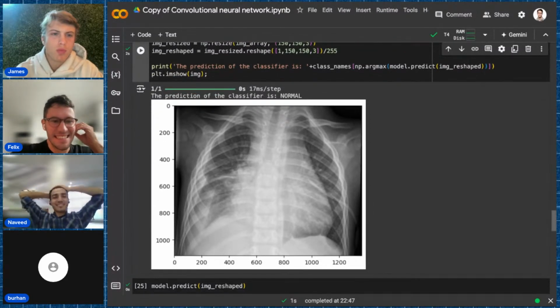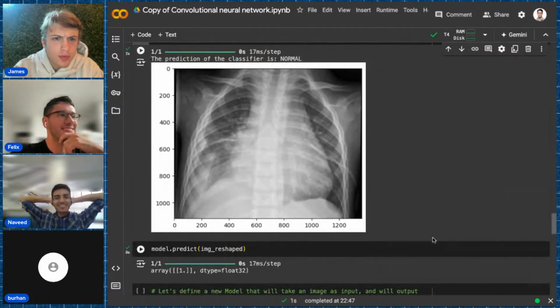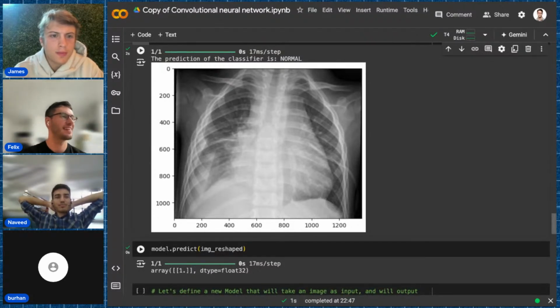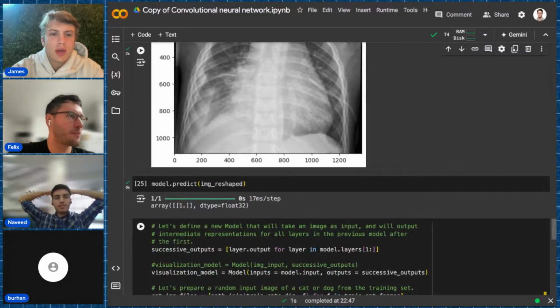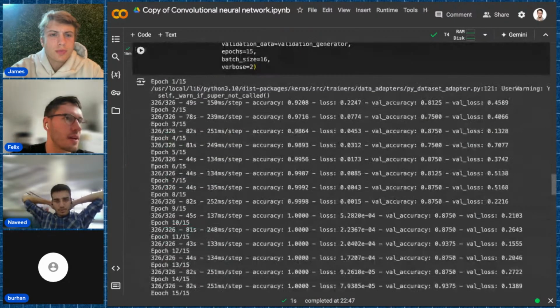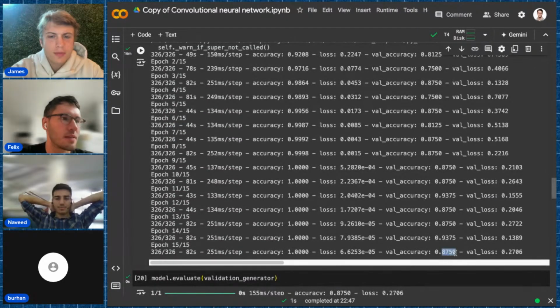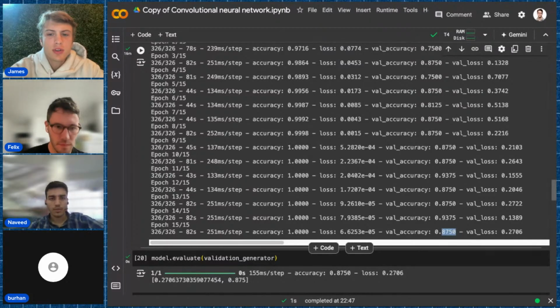Wrong again? Yeah, I mean, what would you say? Felix, this time it's your job to make the prediction of the model accurate by including more layers, making the model more sophisticated. But the model was 79% accurate, right? Even 87, I think. 87% accurate. Well, it only gave 15 or 16 validation images, right?